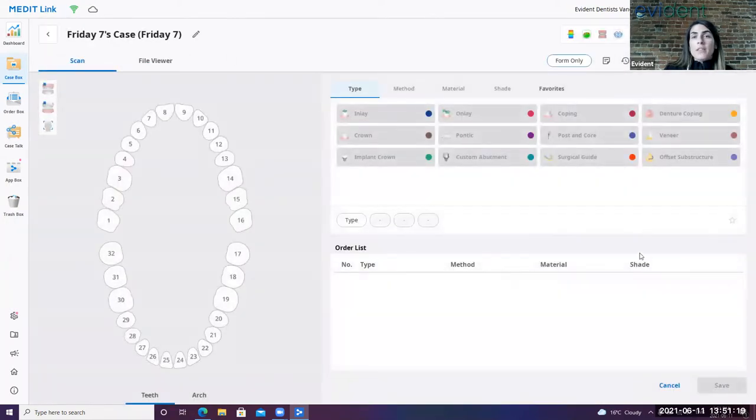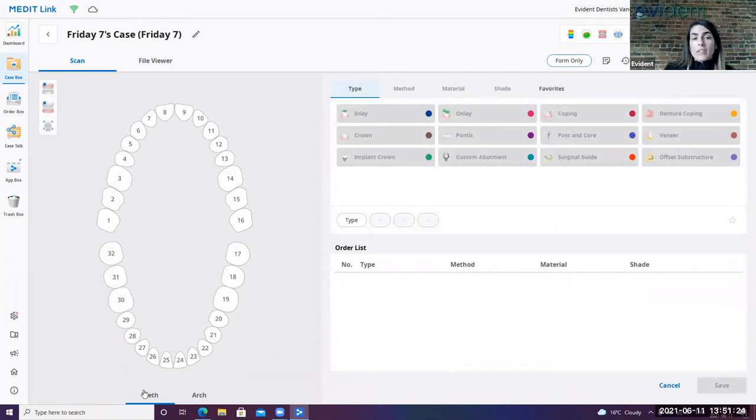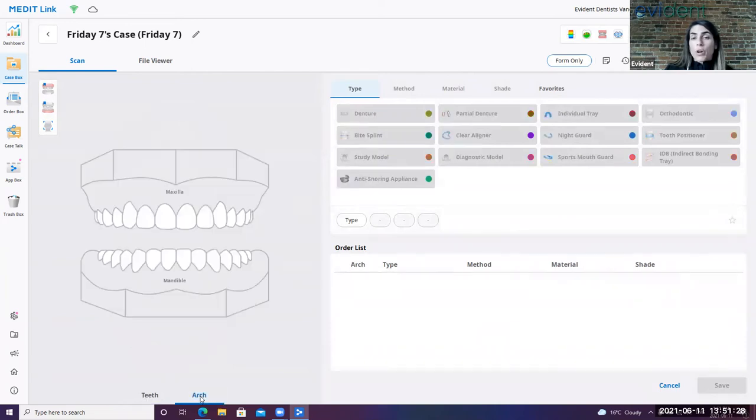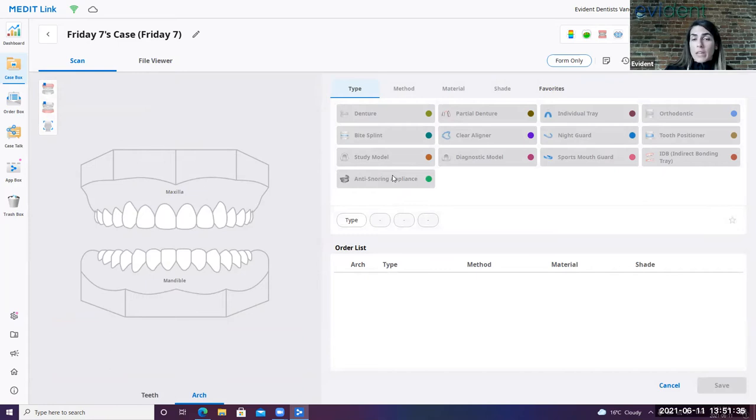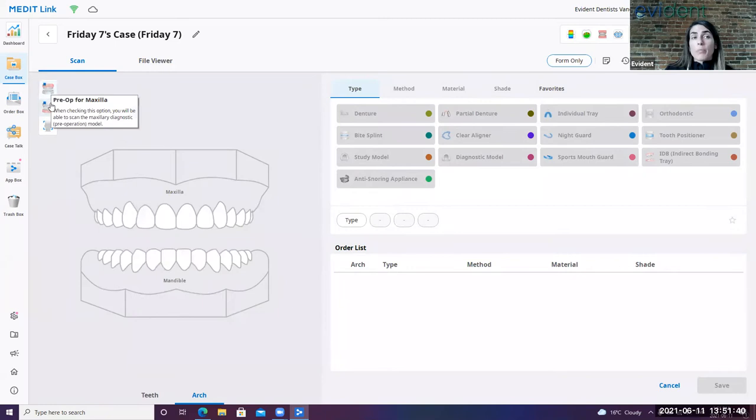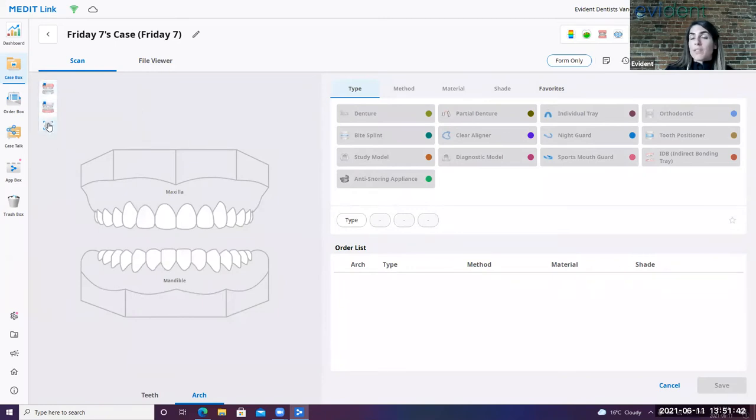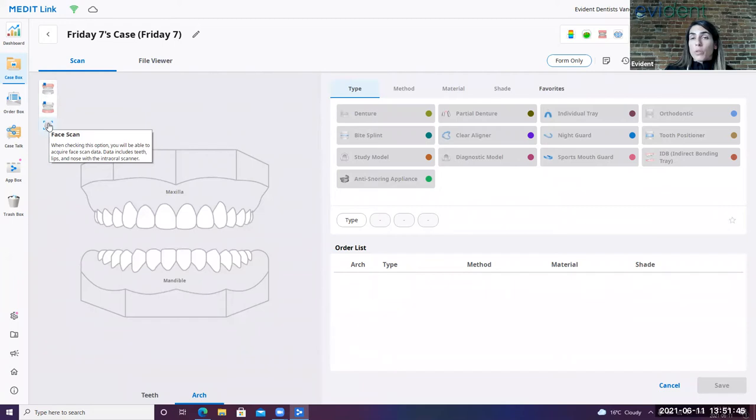So in the screen, this is our prescription that we have available through the Medit. You can see down below here that you can sort your prescription through teeth workflows or through arch workflows. Each of these workflows has been preset in a very specific manner. If there is in the odd chance that you'd like to add extra steps to your scans, you do have the opportunity to select either an upper or lower pre-op scan, as well as a face scan that can be included with your current workflow that's been already preset.